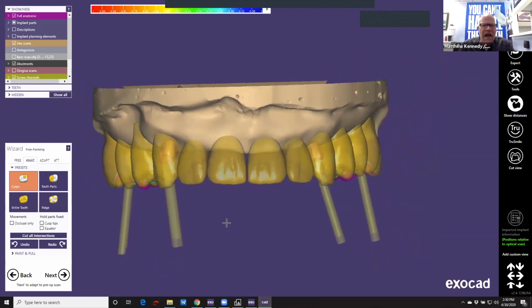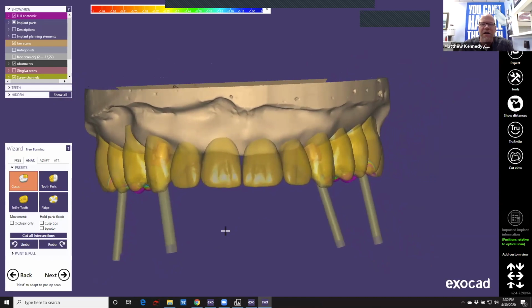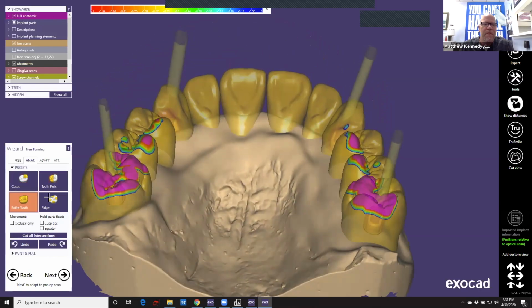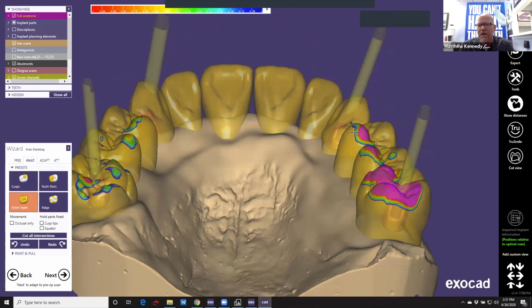And I've tried Bellus, I've tried one from Open Technologies. We've tried a few of them, and it really comes down to, is what you see what you get. And I've found with the Snap, what you see is what you get, because of the process of aligning the face to the jaw scans. So that was a big reason why we made the investment and went forward with that.